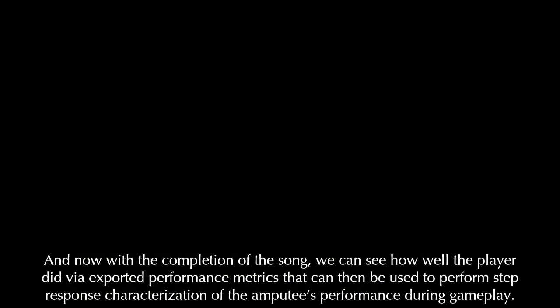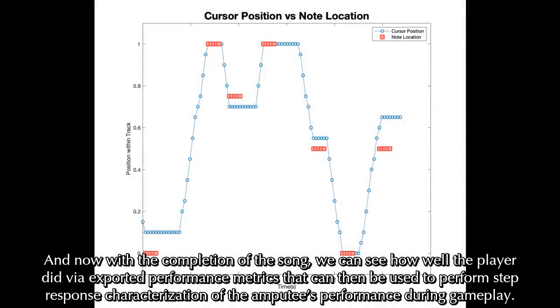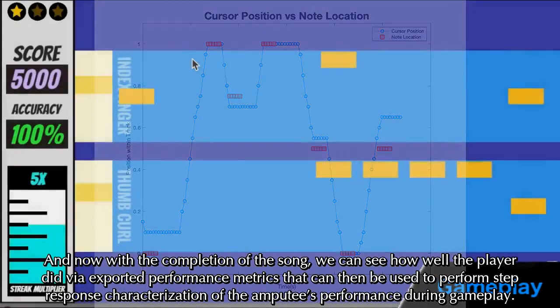And now, with completion of the song, we can see how well the player did via exported performance metrics that can then be used to perform step response characterization of the amputee's performance during gameplay.